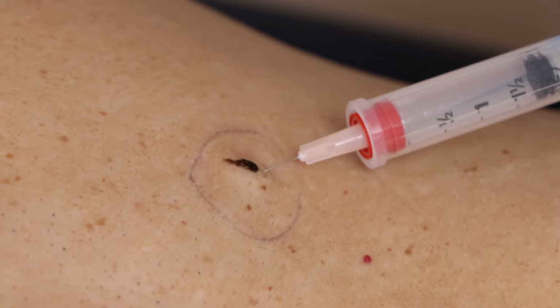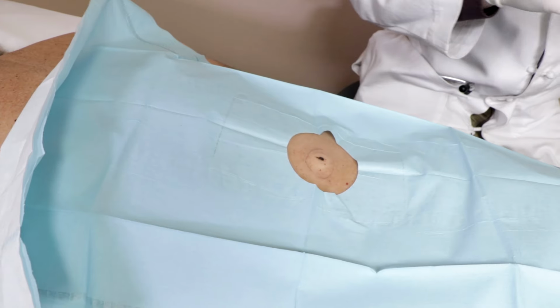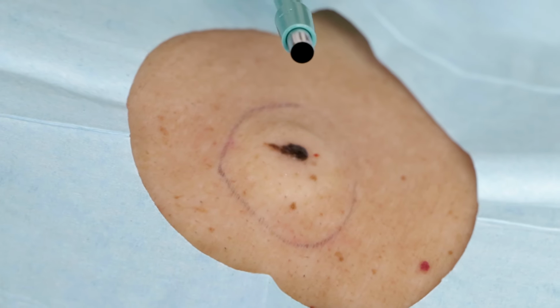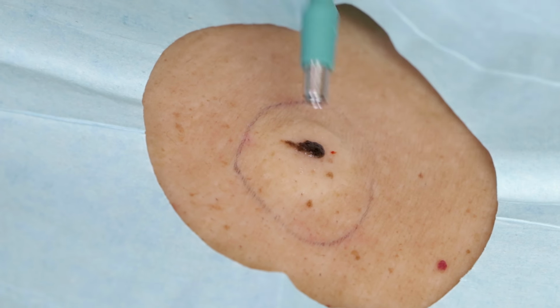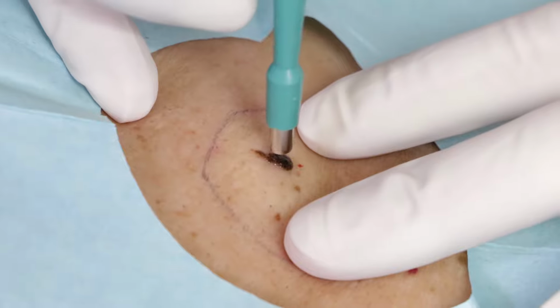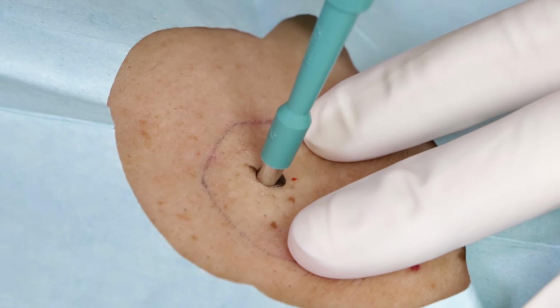I'm using a combination of lidocaine and epinephrine with some sodium bicarbonate buffer that helps it to not sting quite as much. I use a 4 millimeter punch biopsy instrument that allows us to get a little cylinder of the tissue for analysis. And I should go over the ABCDEs of skin lesion evaluation. So I'm going to get the major portion of this, but I want to get a little bit of this tail here too. So I'm going to go right where they connect, get a little bit of both.